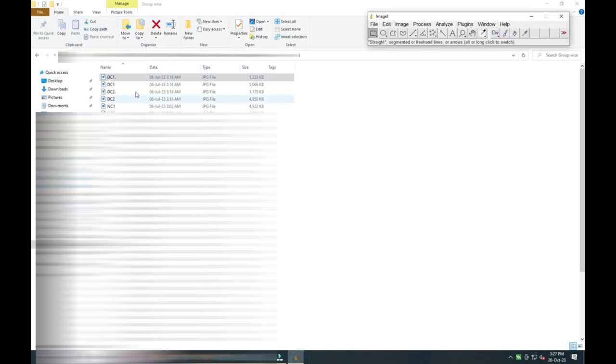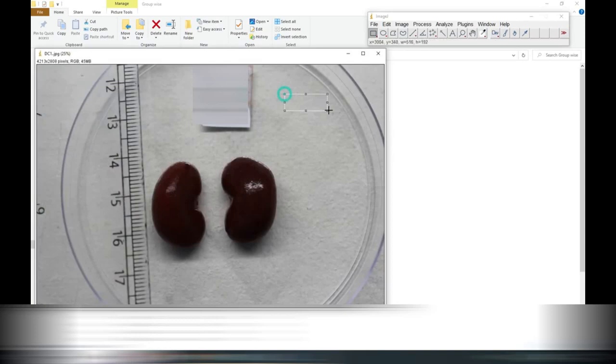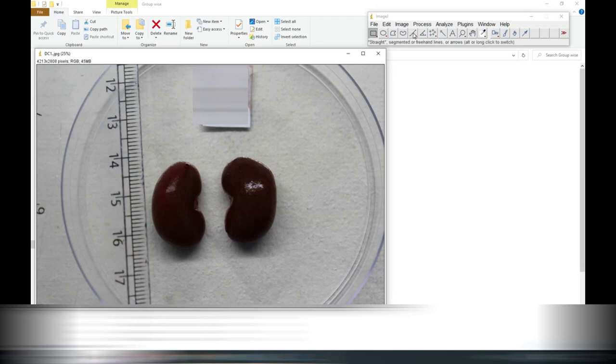Now you can see one simple interface over here. You have to keep one scale besides the image while you are taking the picture and that scale you have to measure here.